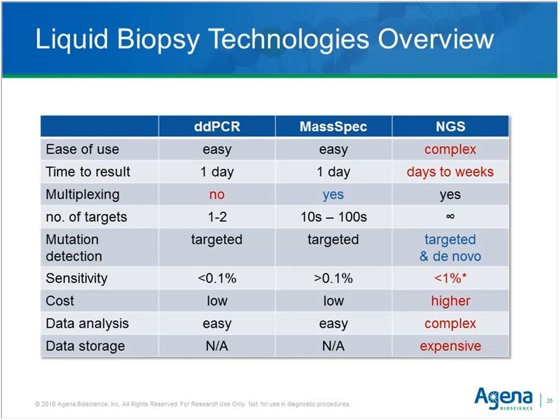But there's a number of categories where NGS may appear to be a little complex. The workflow takes certainly longer than for the other technologies. Sensitivity is not in the absolute desired range unless you drive the coverage really hard, which again drives the cost up. And then a big concern of many is the complex data analysis, where for NGS you require a little bit of experience in bioinformatics, where for the other two technologies you don't. The allele calling just happens at the detection.